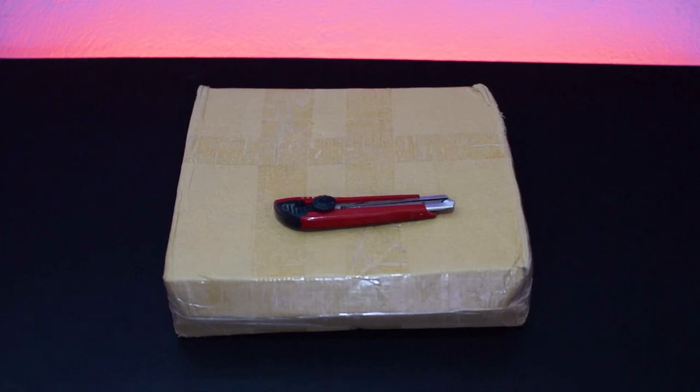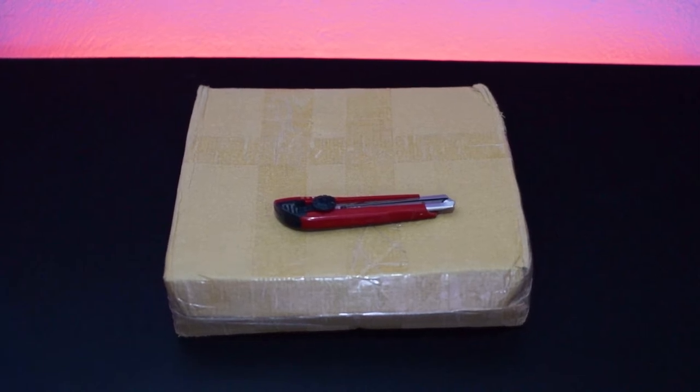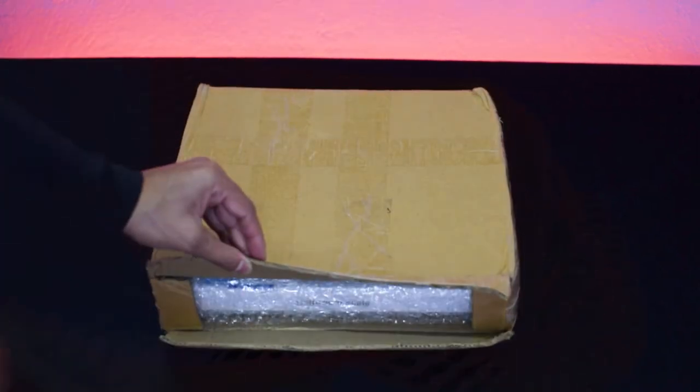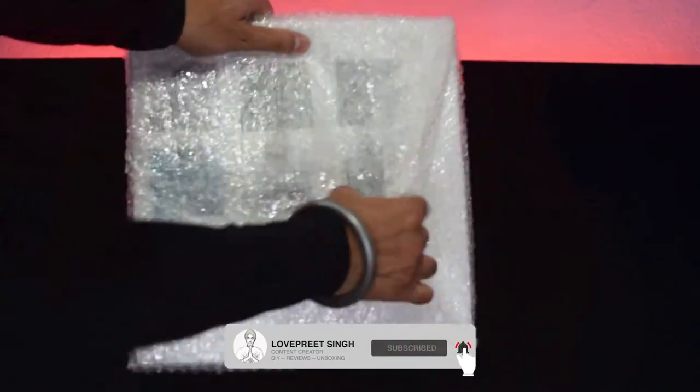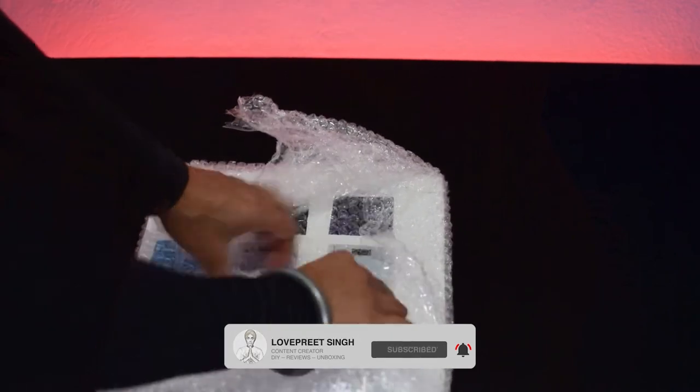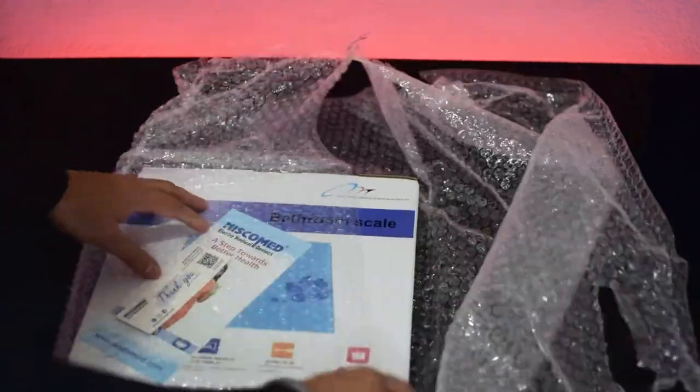Hey, what's up everyone, welcome again to this video. Today I am going to unbox and do a quick review of the Wing Scale. So let's start. Here is the main product package wrapped in bubble wrap. First, remove this wrap and then see how the Wing Scale looks like.